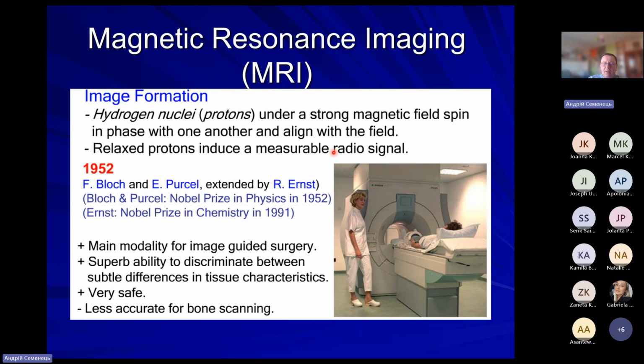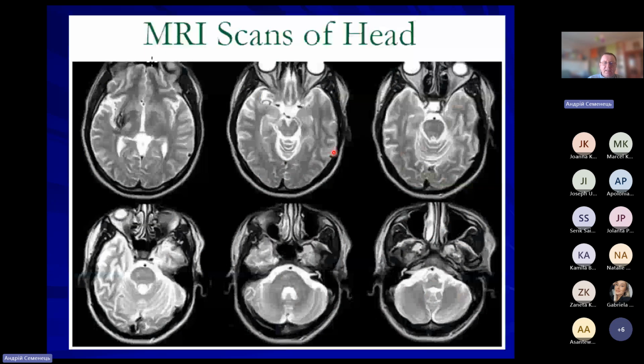But from an information technology viewpoint, they are all the same, because the algorithms involved in image reconstruction are almost exactly the same as in conventional computer tomography. So here we have absolutely different principles, absolutely different physics, but the computational approaches are the same.